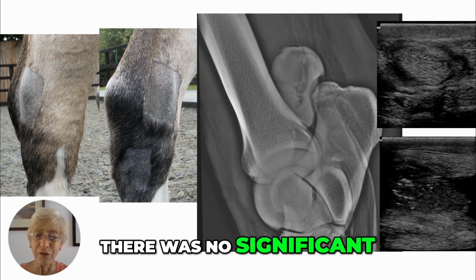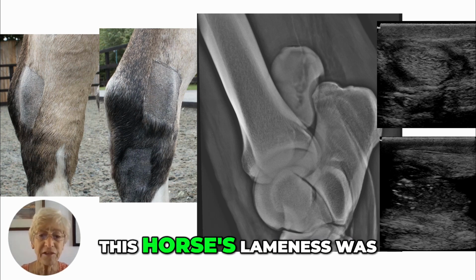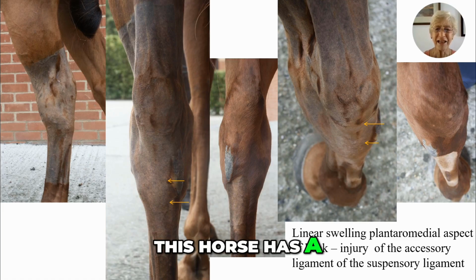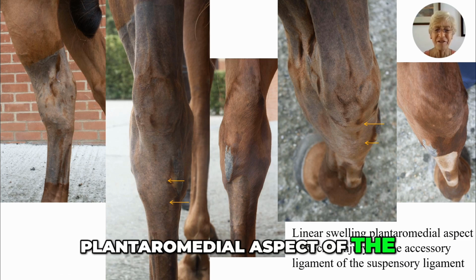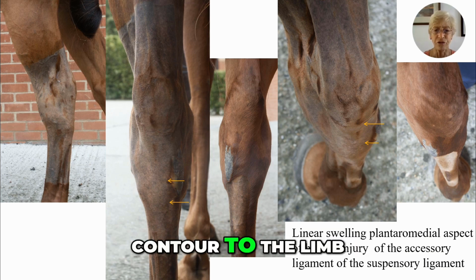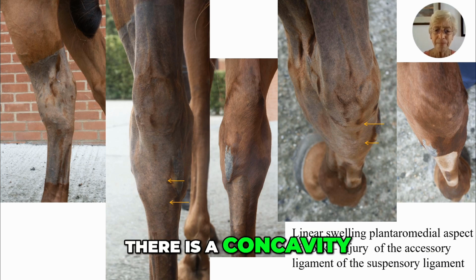Ultrasonographically, there was no significant abnormality within the tarsal sheath other than an abnormal amount of fluid. This horse's lameness was actually associated with proximal suspensory desmopathy. This horse has a linear swelling on the plantaromedial aspect of the distal hock and proximal metatarsal regions, creating a slight convex contour to the limb, whereas in the contralateral right hind limb, there is a concavity.